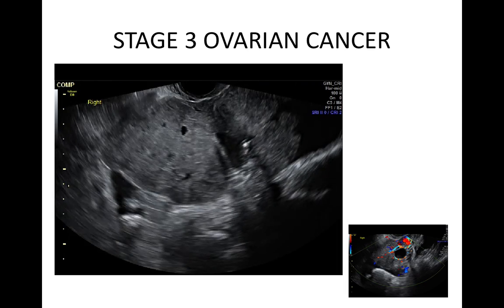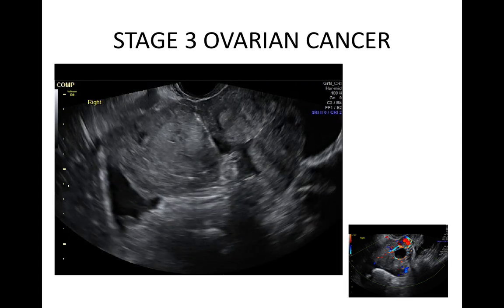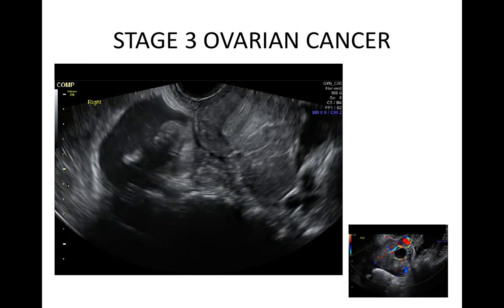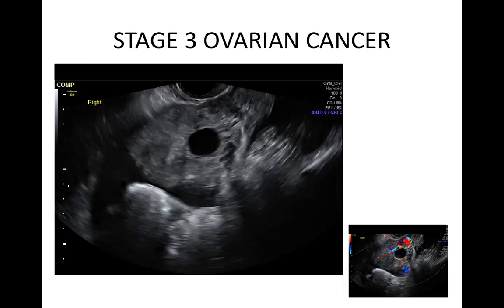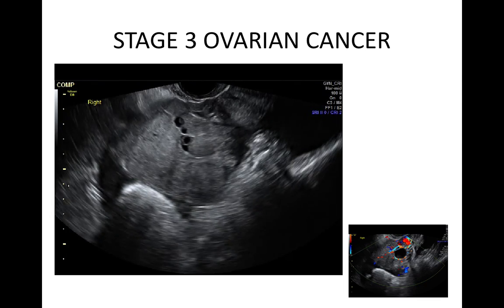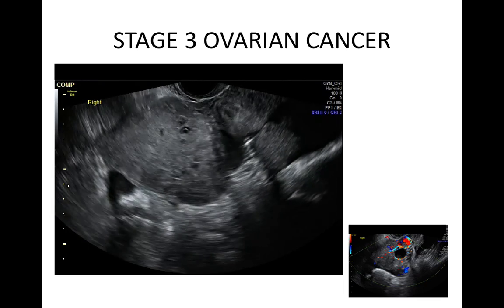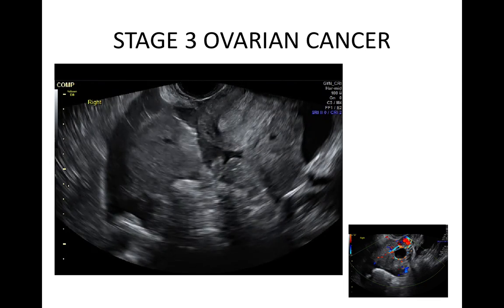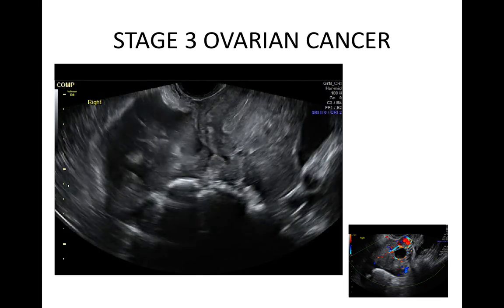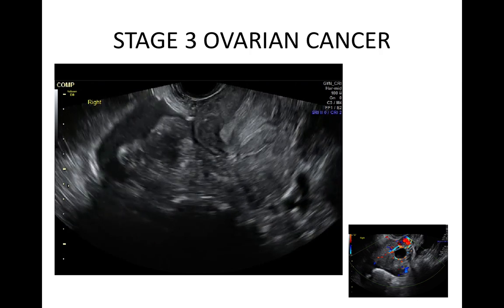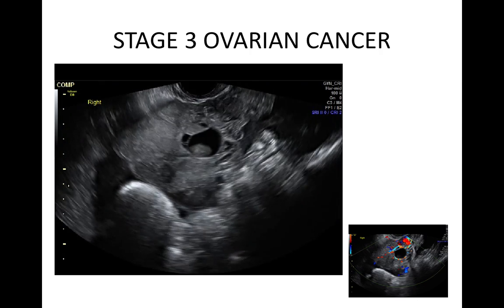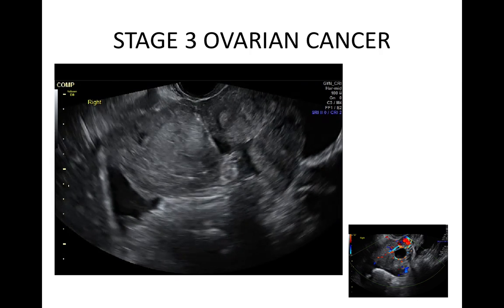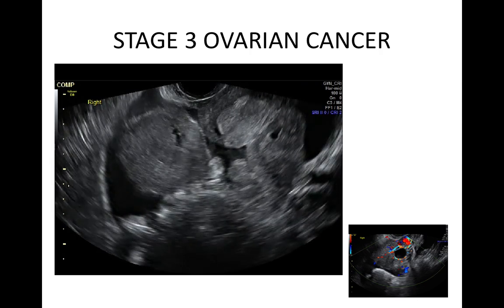This advanced ovarian malignancy is a solid lesion, as more than 80% of the lesion is solid rather than cystic. It is irregular both in external outline and the internal cystic spaces. The vascularity was strong in areas. There is shadowing and there is ascites.